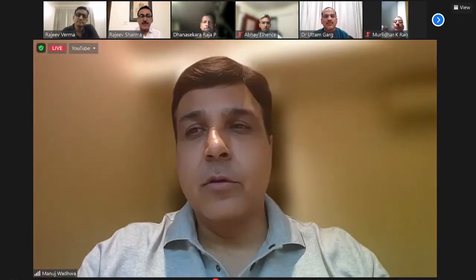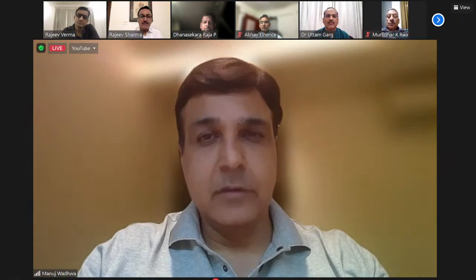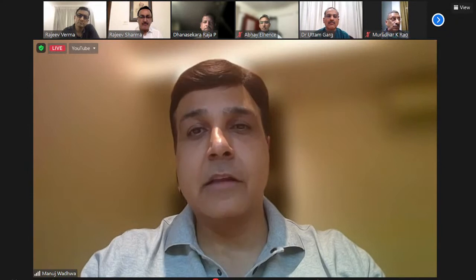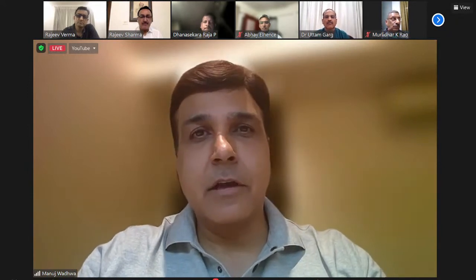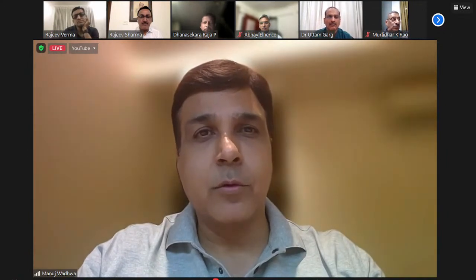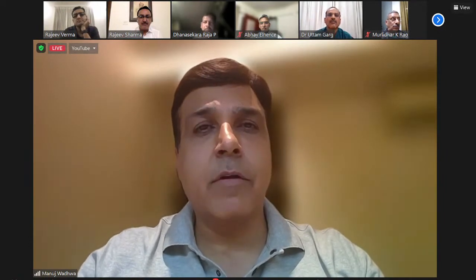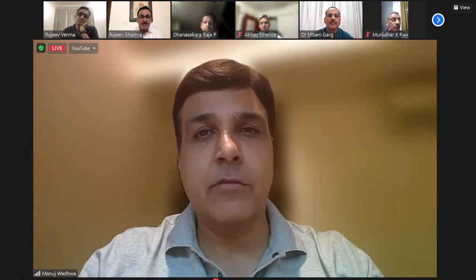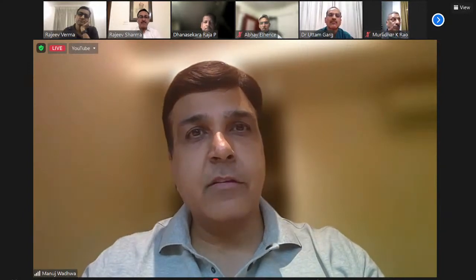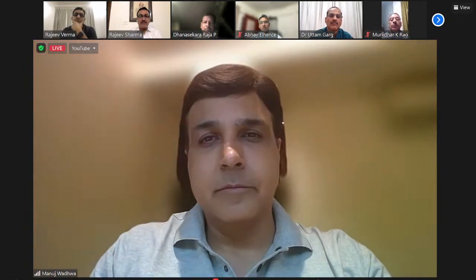Yeah, please. Rajiv, this question goes back to Dhanasekhar and you, specifically on your experience. When we talk about a complex varus knee, today the talk is, let's go in for a kinematic alignment, leaving the knee 3 degrees of varus, rather than doing an osteotomy. Now, vice versa, Dhanasekhar, you have a knee which is trapezoidal, and you have 2 choices. One is doing a lateral epicondylar osteotomy, and the second is putting your femur in some amount of internal rotation, where you can still balance your patellofemoral dynamics. In which case would you prefer a few degrees of internal rotation, and where would you prefer an osteotomy?